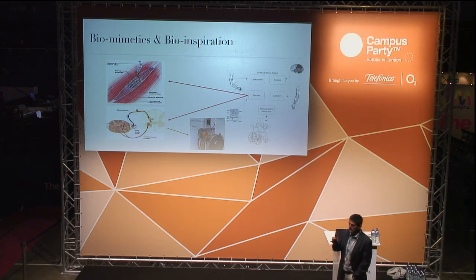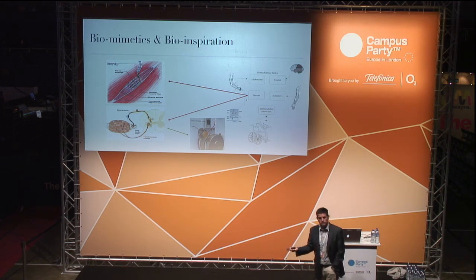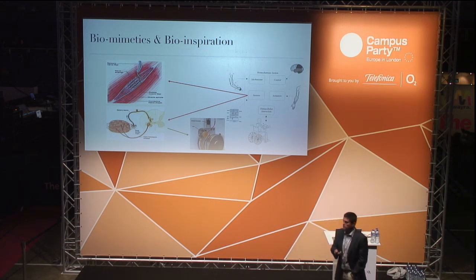And the selection of these particular sensors is based on our observation of the different sensors that we integrate in our muscles to be able to control our limbs. So basically, in our muscles, we have Golgi tendon organs, which measure the force at the tendons, the insertion points of the muscles to the bones. So this is equivalent to the force sensors that we have in our exoskeleton.